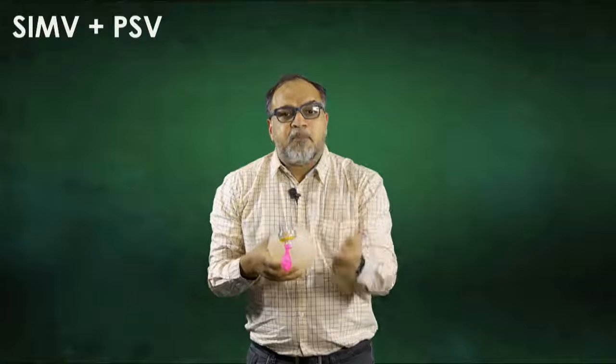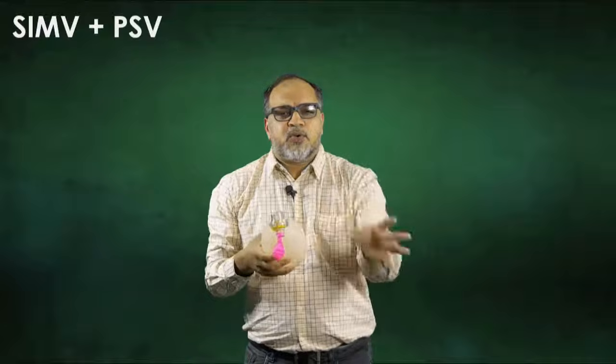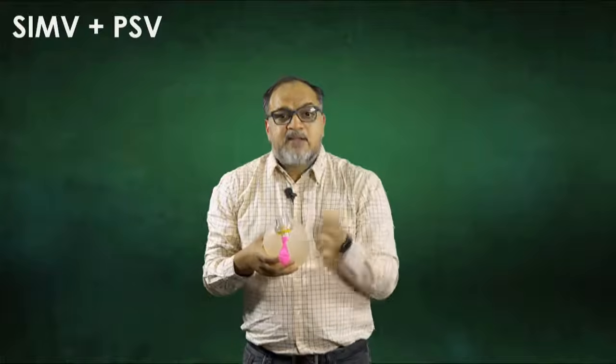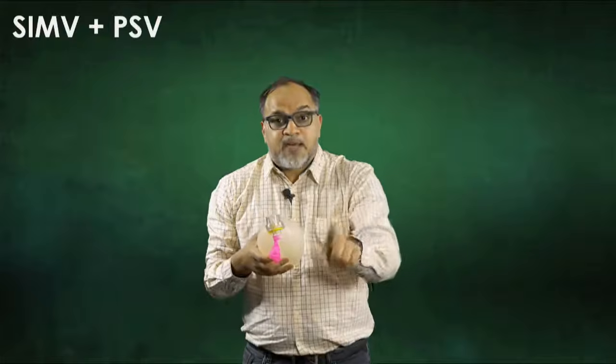The ventilator will support it with 15 centimeters of water. Maybe the tidal volume will go to 200, 300, 400 depending on the patient's effort. So 1, 2, 3, patient triggered, the ventilator will support it with pressure. It will not give a full tidal volume like ACMV. It will support it with 15 centimeters of water pressure, just like the PSV mode.